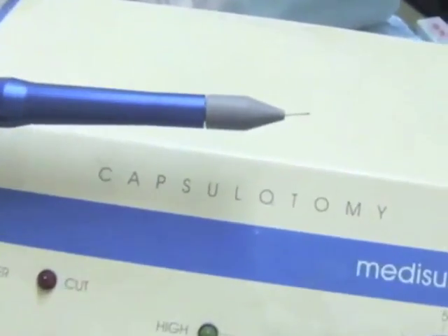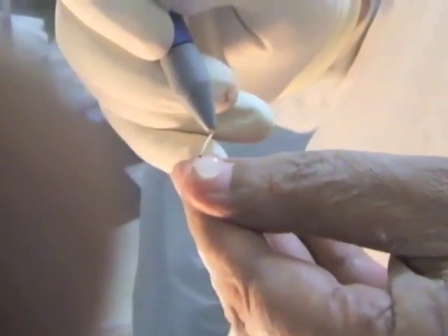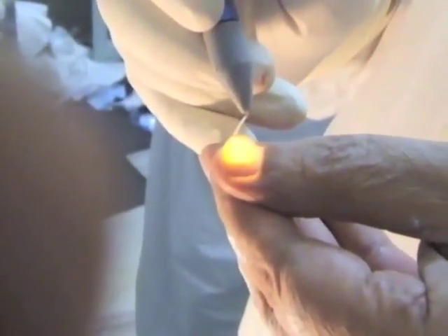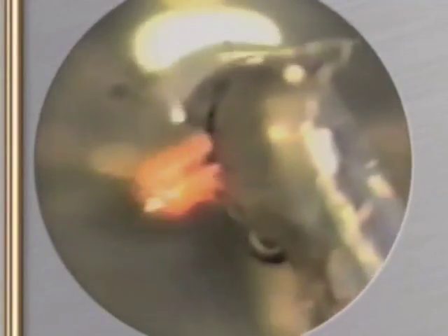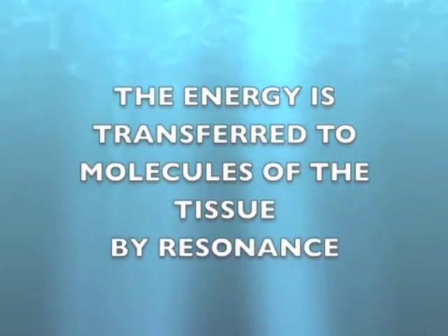Here is the console, the handpiece and the tip. The tip produces cool plasma energy which has the power to ablate tissues. The metal filament is surrounded by the yellow plasma — this is what cuts.